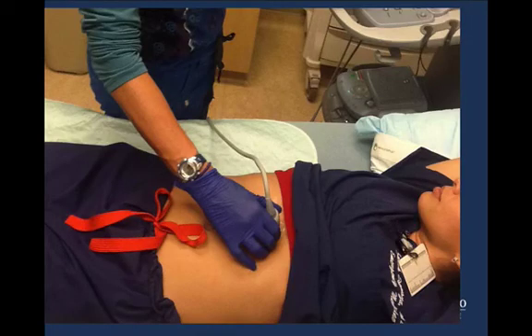This is what it will look like when we scan a patient in the transverse view to visualize the aorta. We maintain the steady pressure on the abdomen as we slide the probe all the way down to about the level of the umbilicus.